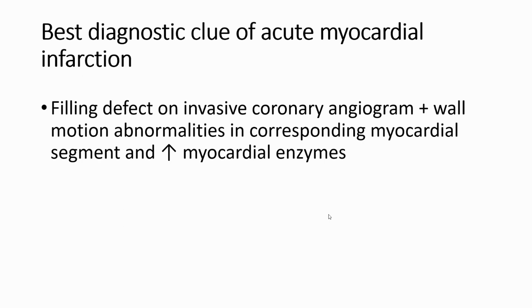So what is the clue? Acute infarction means a filling defect on invasive coronary angiogram, plus wall motion abnormality in the corresponding myocardial segment, and increased myocardial enzymes.